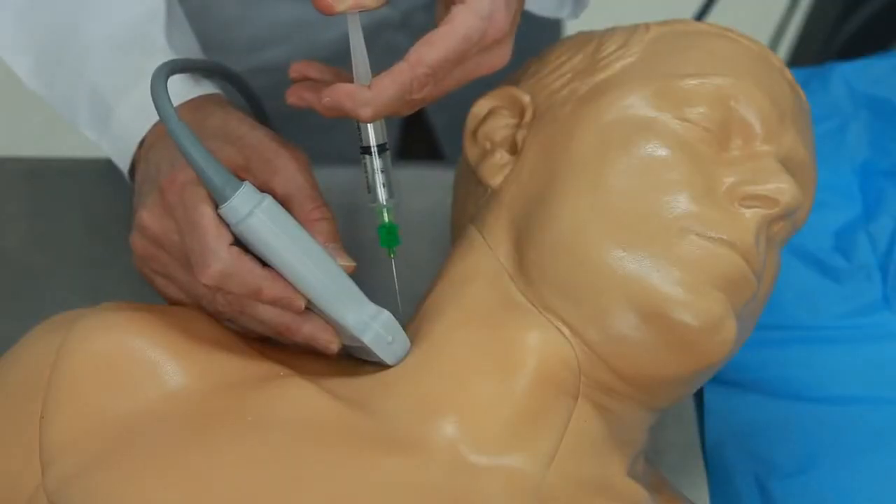We've added the supraclavicular nerve capability and more tissue area, allowing users to practice the posterior interscalene nerve block approach.